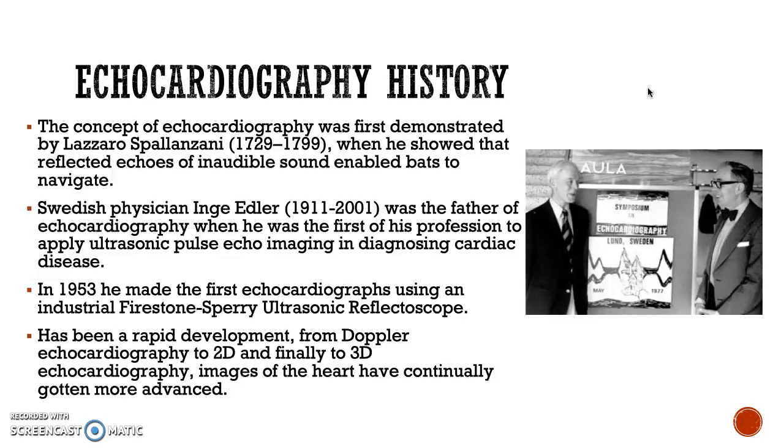But a Swedish physician, Inge Edler, was the father of echocardiography when he was the first of his profession to apply ultrasonic pulse echo imaging in diagnosing cardiac disease. In 1953, he made the first echocardiographs using an industrial Firestone Sperry ultrasonic reflectoscope.